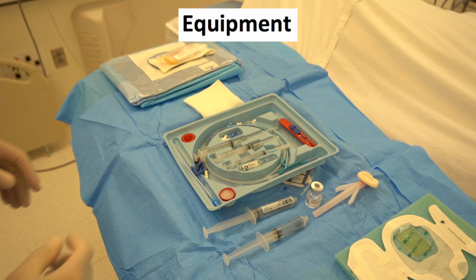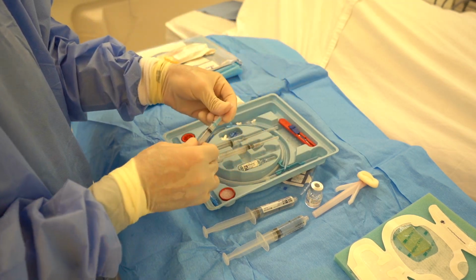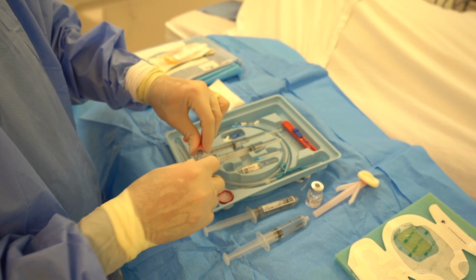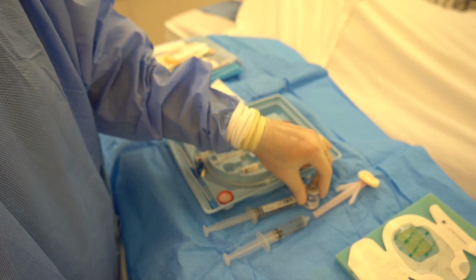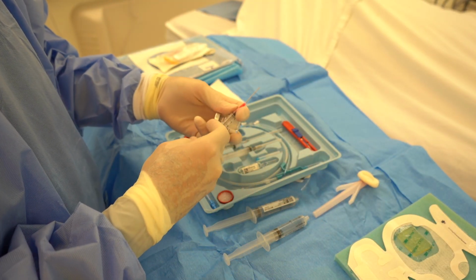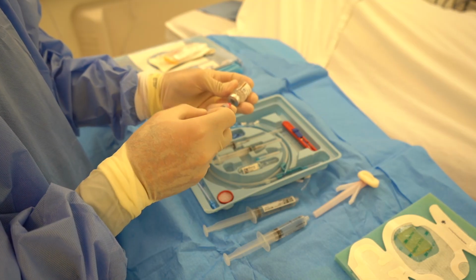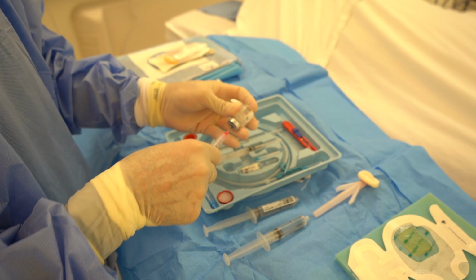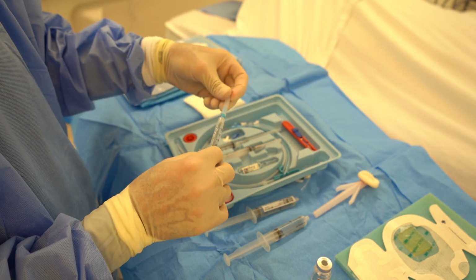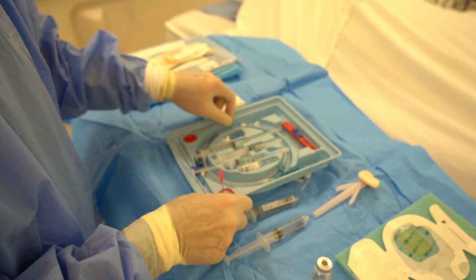As we set up our equipment, obviously every institution may have a slightly different kind of kit that you'll be utilizing, but fairly standard across those institutions. In this case, we're drawing up our lidocaine. Sometimes that comes with a cracked vial, sometimes that comes with a rubber top. Here we're injecting some air and pulling back about 3 to 5 cc's, which should be adequate for an internal jugular approach. You may need a little additional for more subcu to traverse for a femoral line, for example.